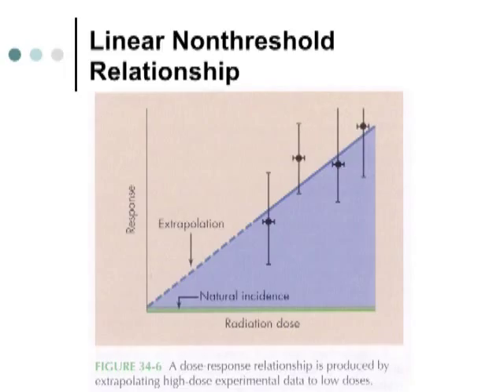Those are measured at higher doses of radiation, but it's believed that there is immeasurable damage at lower doses as well. So we assume that any amount of radiation could be harmful, and we always try to keep the dose as low as reasonably achievable. It's called the ALARA concept, to ourselves and to our patients.